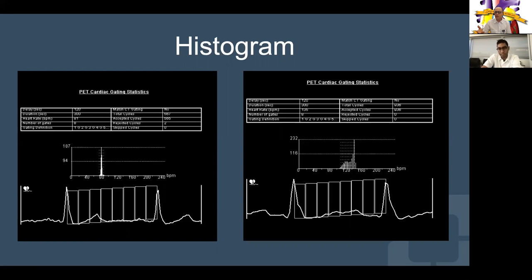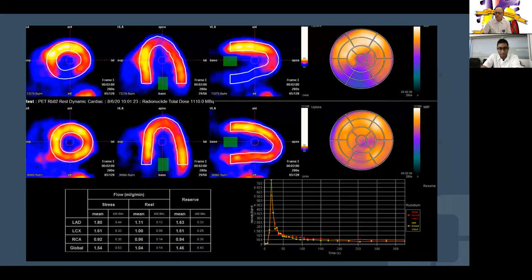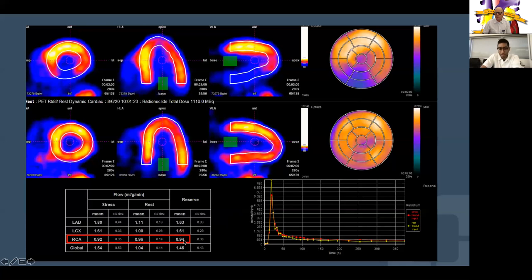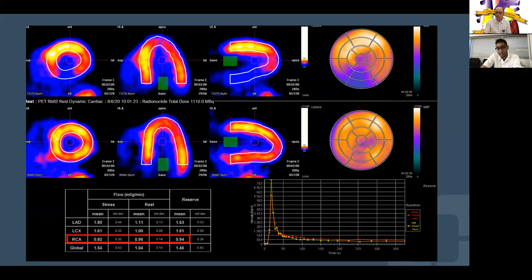Looking at myocardial blood flow, the stress and rest values show: LAD flow reserve 1.6, circumflex 1.61, and RCA significantly low at 0.94, with a global reserve of 1.46. Normal threshold is approximately 1.7-1.8. The RCA value is significantly low, consistent with all the imaging findings seen so far.